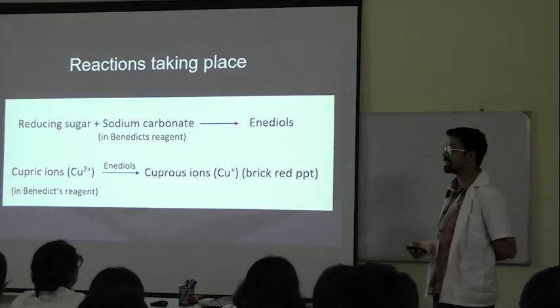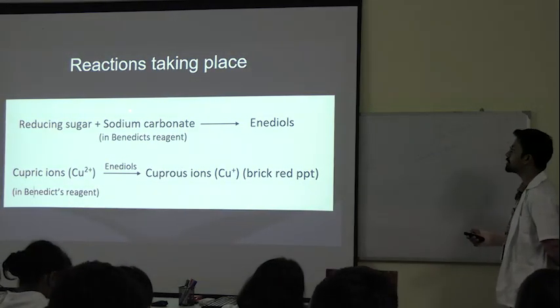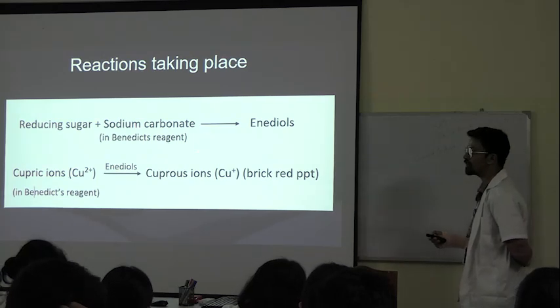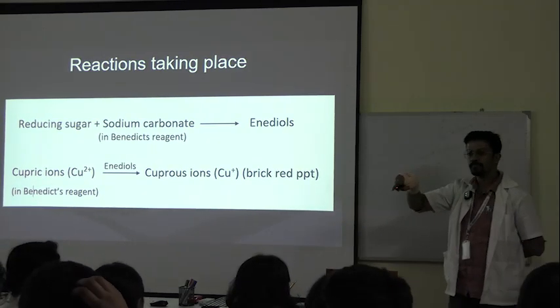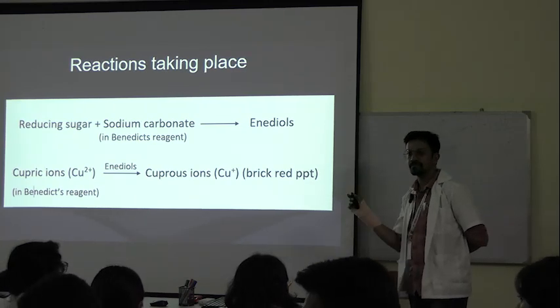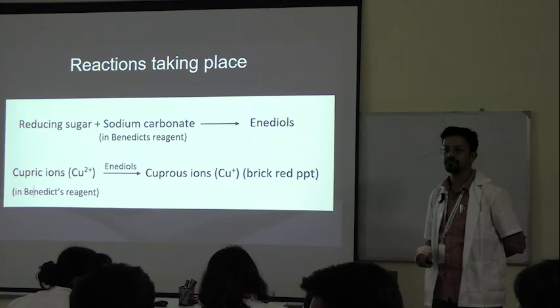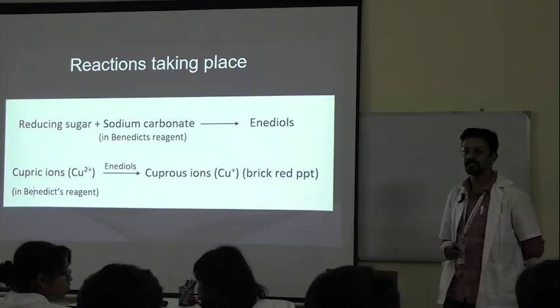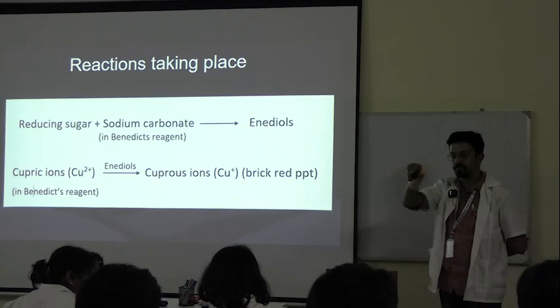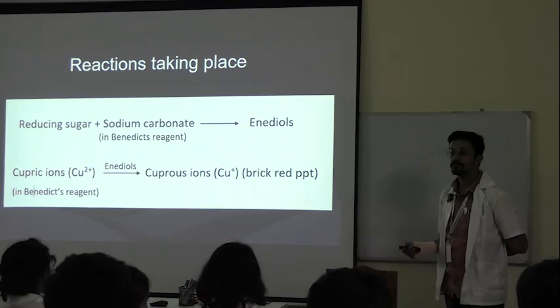Now this is the reaction that is taking place that I was talking to you about. The reducing sugar is reacting with the sodium carbonate. Sodium carbonate is doing what? Acting as a reagent. Say. Sodium carbonate is doing what? As a reagent. At least stand up, then say the answer. Not you, behind you. It's acting as a reagent in the reaction.